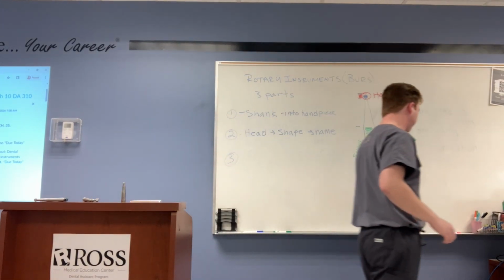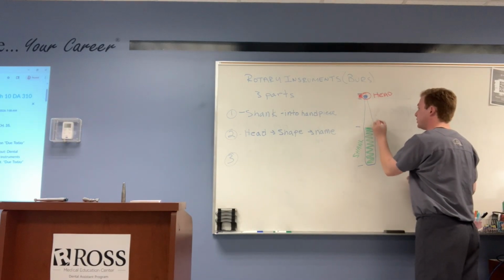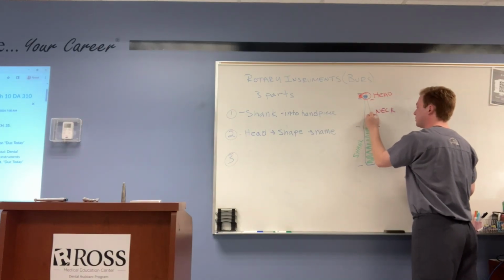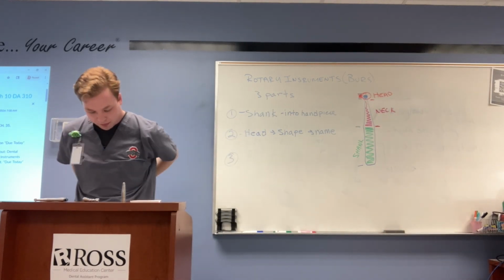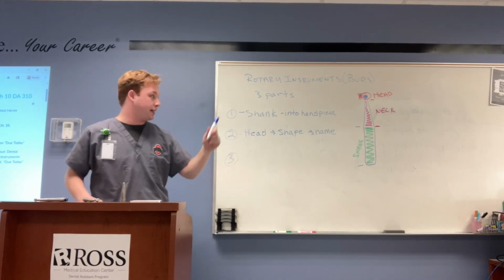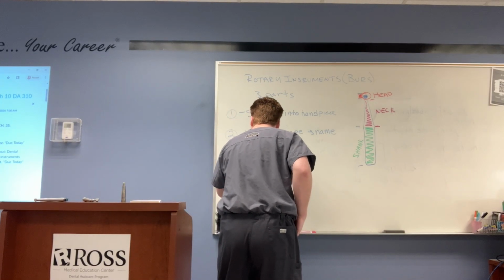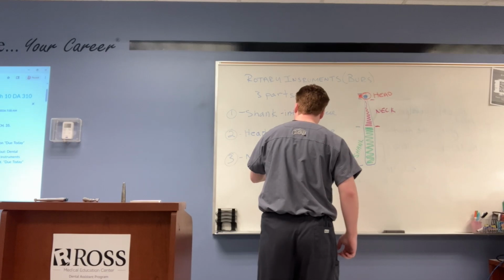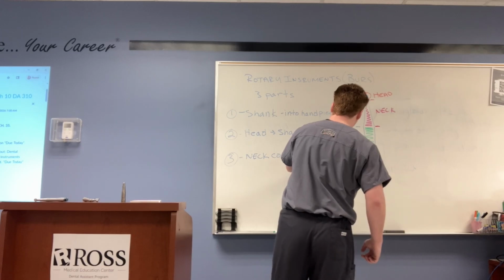So just like any other neck, like the neck of the tooth, that joint there, this right here, this portion is the neck. And all you need to know about the neck is that it connects the shank with the head. So the neck connects the shank to the head.